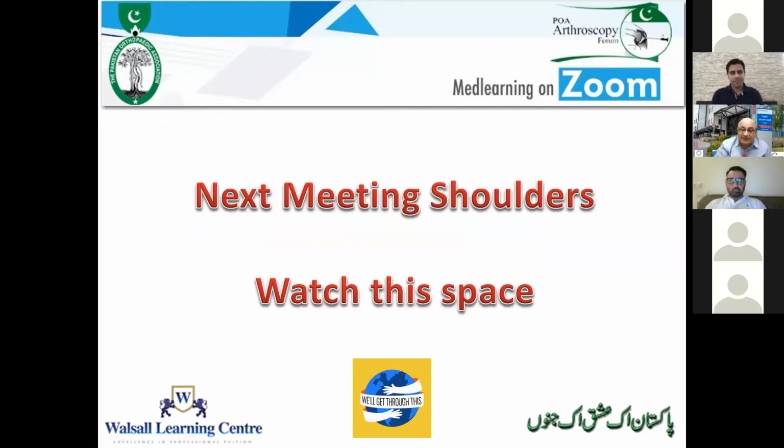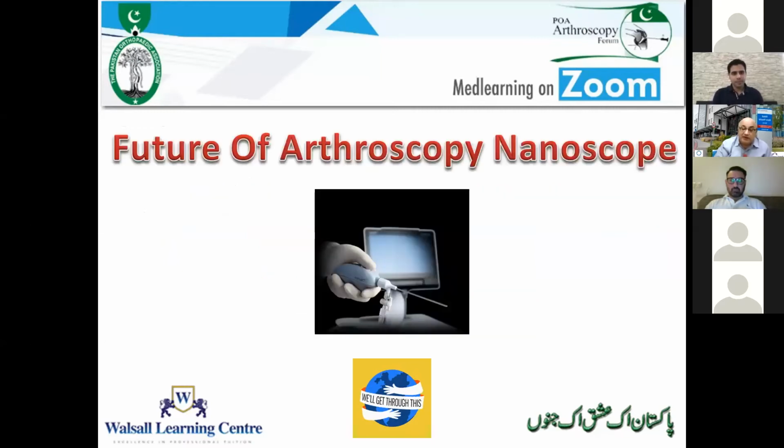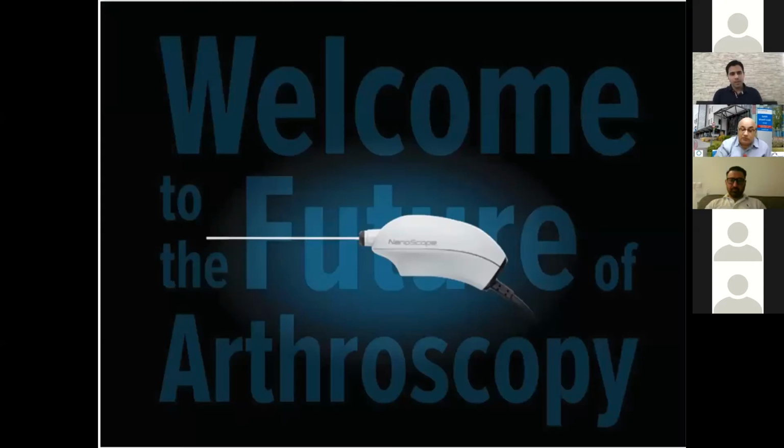You make me talk about stuff that I have no clue of, and I will give you my experience of the nanoscope. We are working wonders with the nanoscope at the moment. We are doing balloons. We are injecting cuffs. We are doing diagnostic features. So I think this is the way for the future, especially if you can't bring everybody in the theater. We are very restricted with capacity in our hospital, as is most of NHS in the UK. But so we are making use of various things.